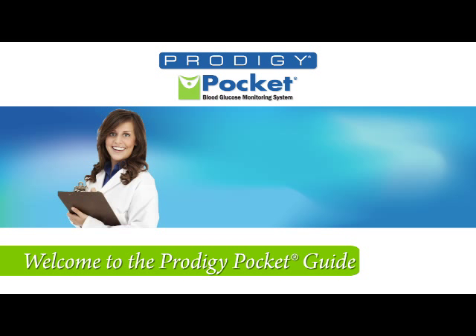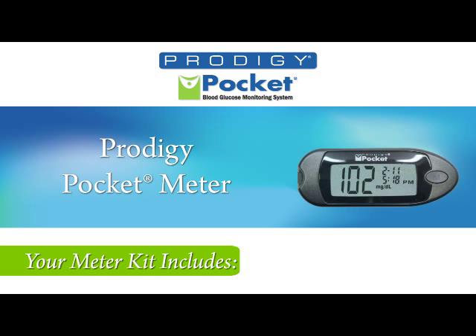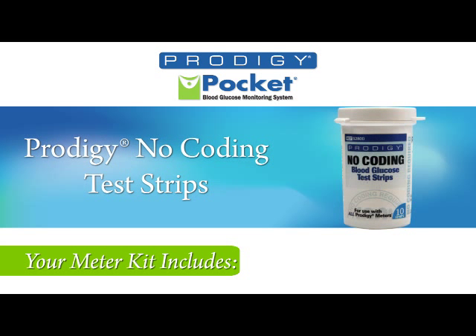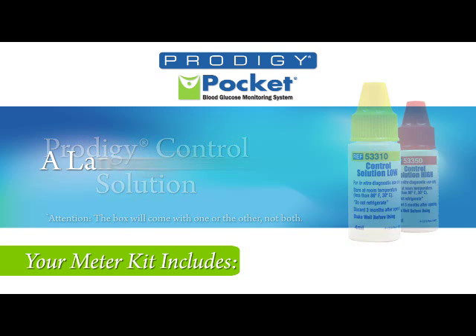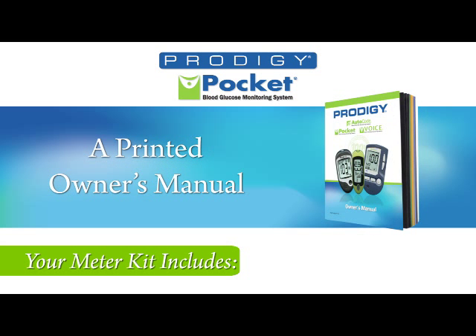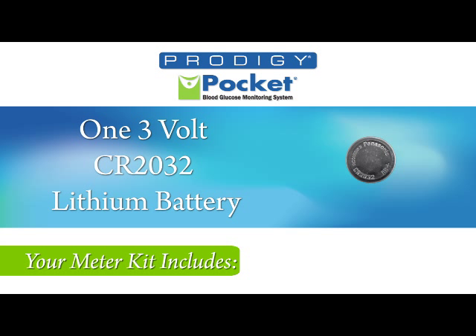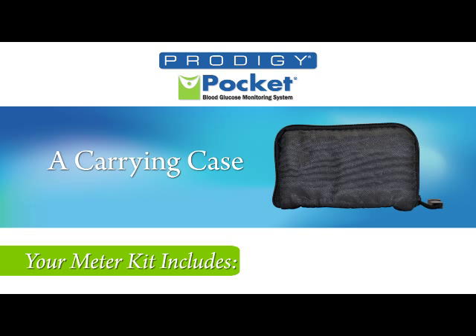Welcome to the Prodigy Pocket Meter. Upon opening the box, you'll find inside the Prodigy Pocket Meter, Prodigy No Coding Test Strips, Prodigy Control Solution, a lancing device, lancets, printed owner's manual, logbook, warranty card, one 3-volt CR2032 lithium-ion battery, and a carrying case.